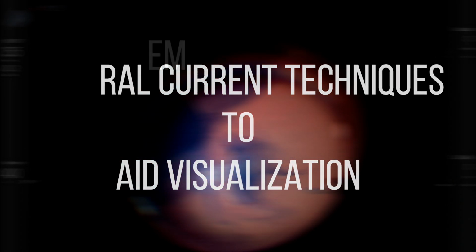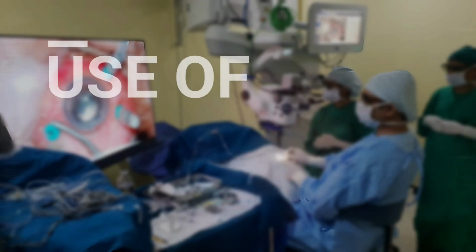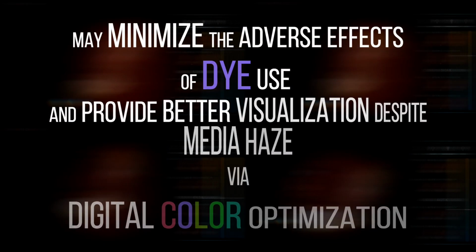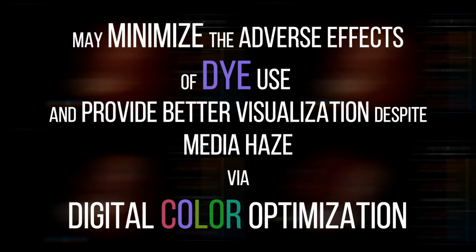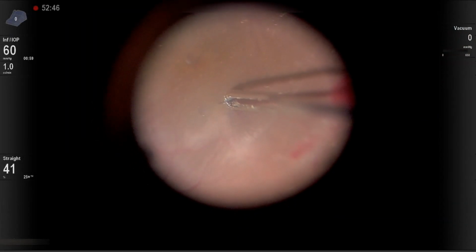Now, looking into the digital filters, we have come into the digital era. Several current techniques aid visualization. Dyes may have adverse clinical consequences, so the use of digital visualization may minimize the adverse effects of dye use via digital color optimization.